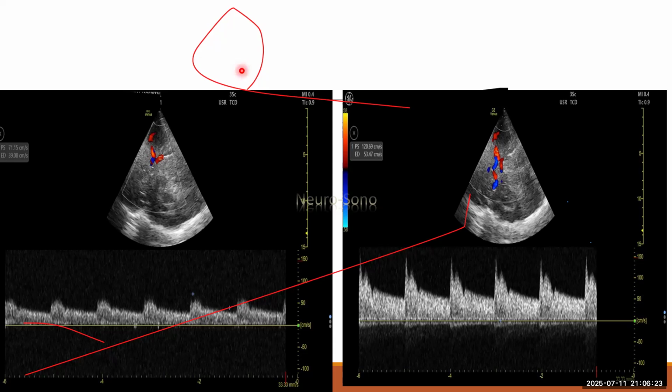Yeah, that's fine. So the waveform identification is done. It is a transtemporal window. What are the waveforms indicating? Is it normal, abnormal? So the velocities are low, probably acceleration. The velocities are in sort of cutoffs with the normal velocities, which the slide I had earlier put up.